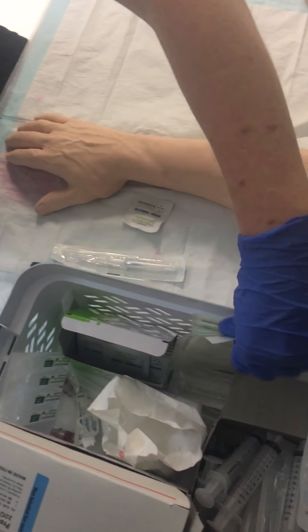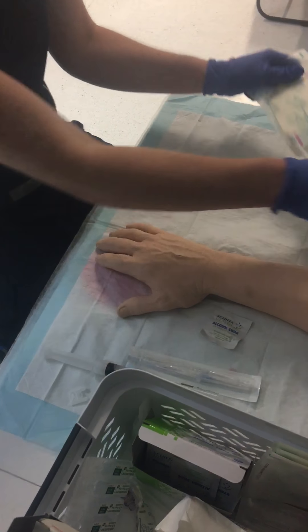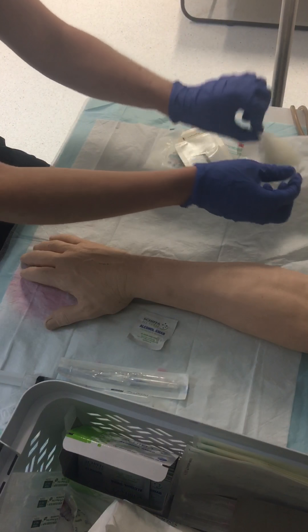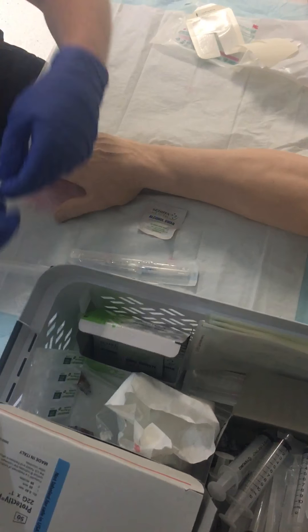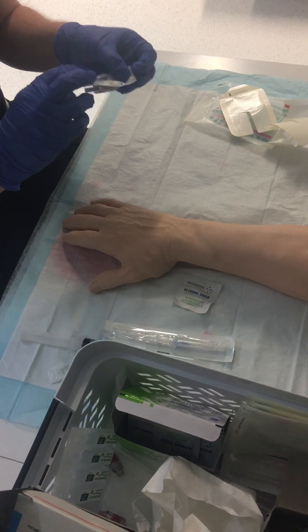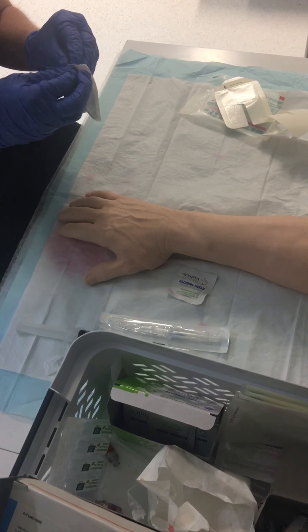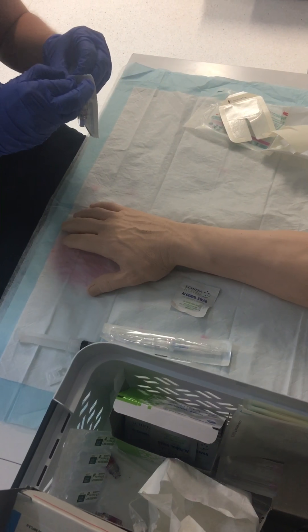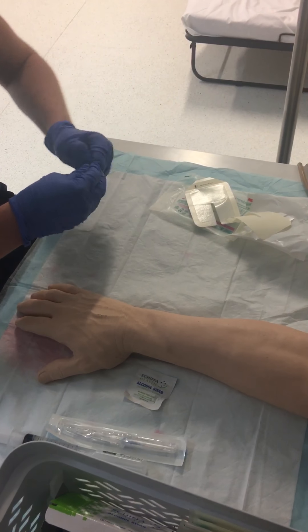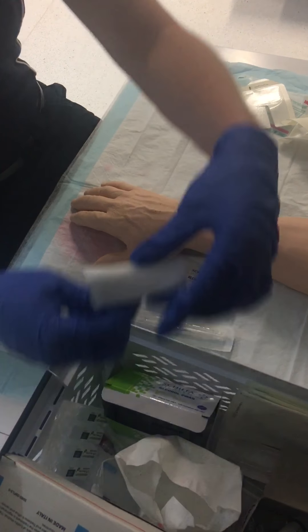I've got my alcohol swab. I've got my tegaderm — just going to pull this part off — and I've got some gauze.